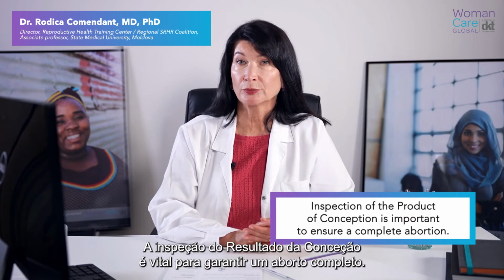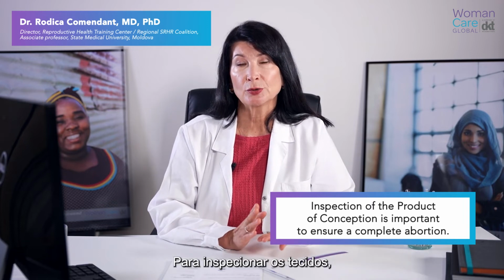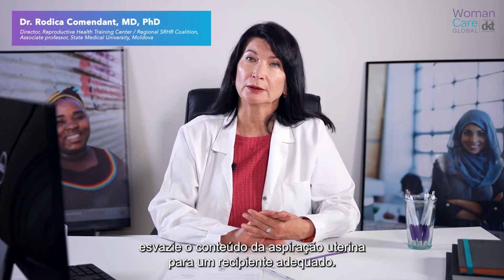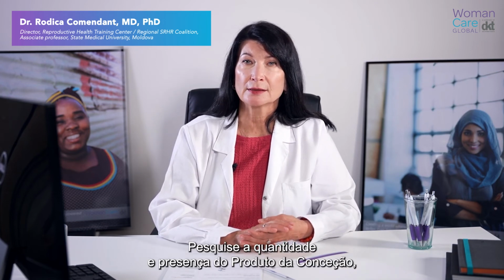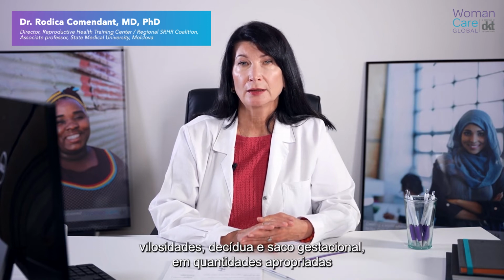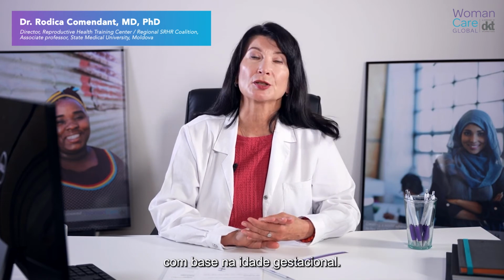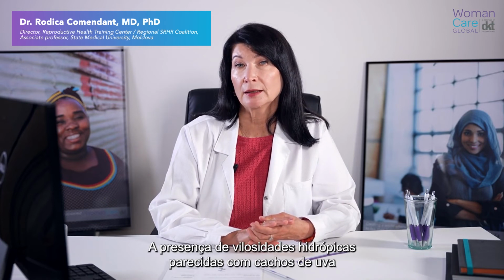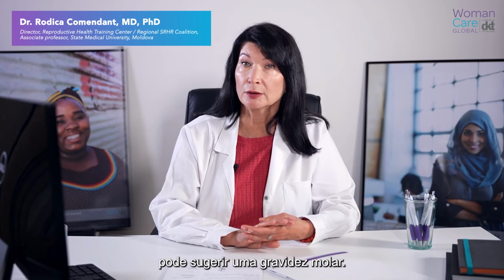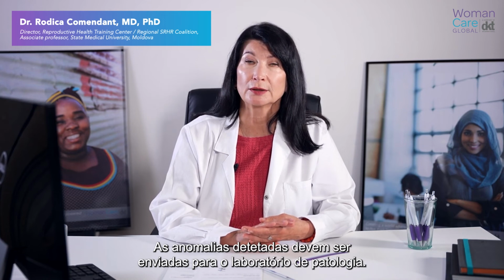Inspection of the product of conception is important to ensure a complete abortion. To inspect the tissue, empty the uterine aspirate into an appropriate container. Look for the quantity and presence of the product of conception, like villi, deciduum, and sac, in appropriate quantities based on gestational age. After nine-week gestation, fetal parts are visible. The presence of grape-like hydropic villi may suggest a molar pregnancy. Abnormal findings should be sent to the pathology laboratory.